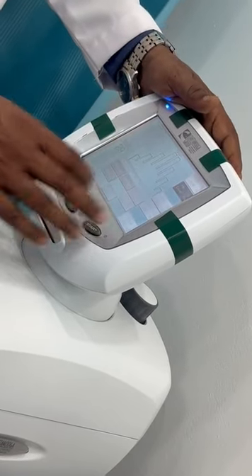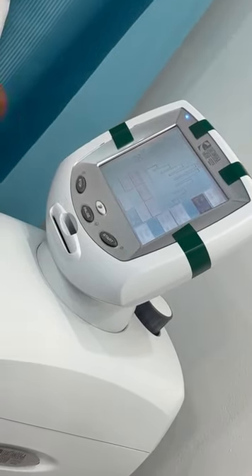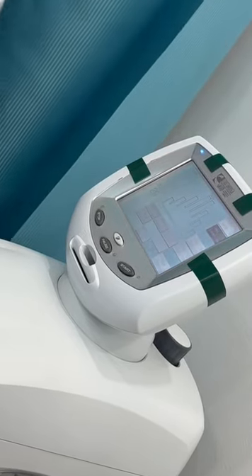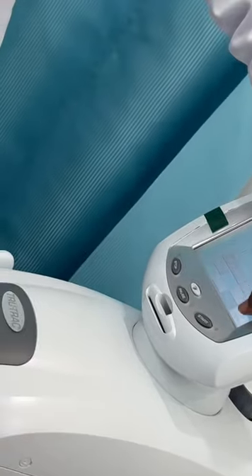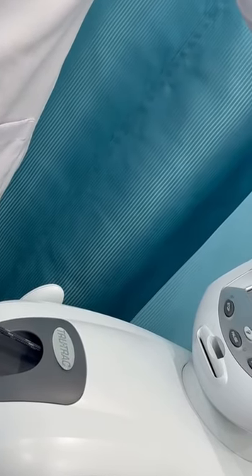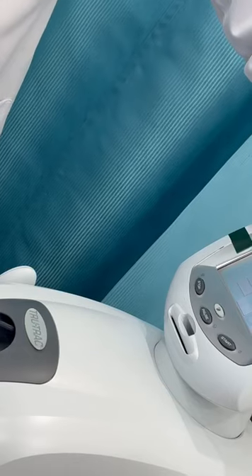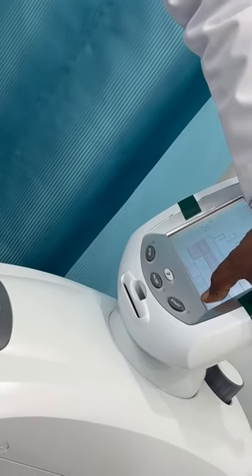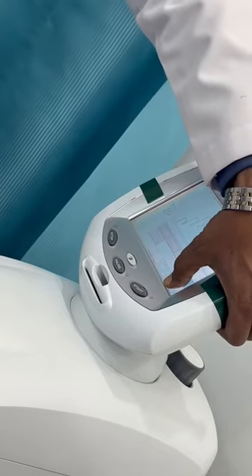Once everything is set and the patient is positioned correctly, press this one and release. Don't leave it like this, it will go and strike and damage it. So leave this one, press again, just move it like that and leave.